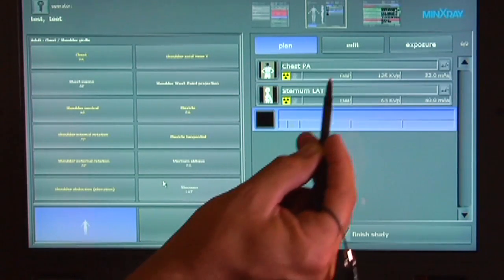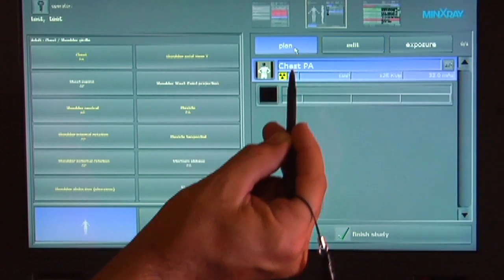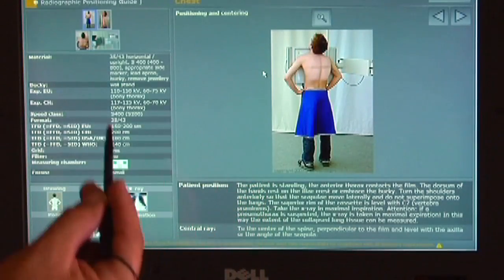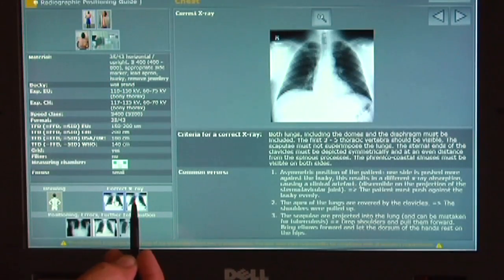Use the edit tab to delete unwanted or duplicate exams. Once all exams are planned, select the exposure tab. Click on the position thumbnail to view the position guide. The position guide contains pictures, digital radiographic images, and video descriptions.